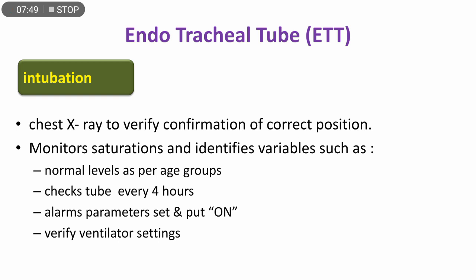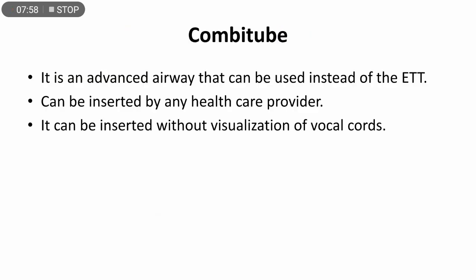Check the tube every 4 hours. Alarm parameters are set and kept on all the time. Verify the ventilator settings.